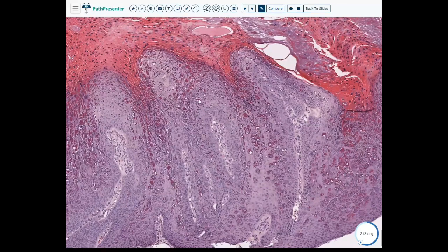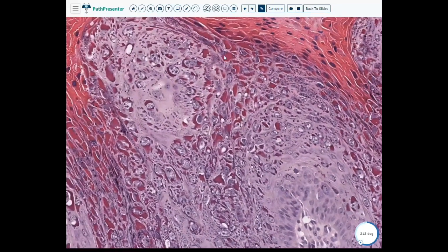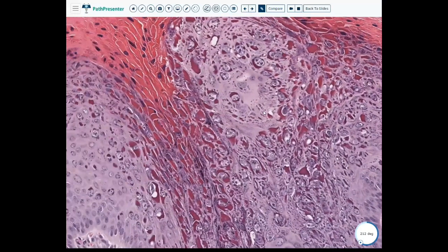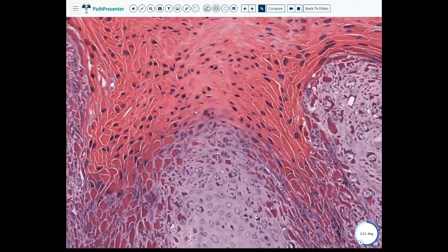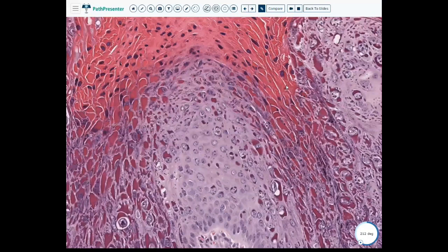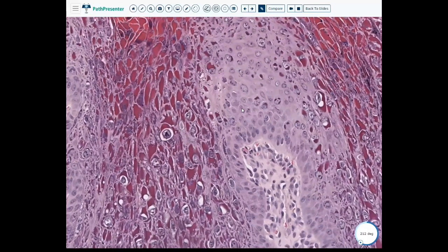These are not necessarily granular layer — these are keratohyaline granules associated with Verruca vulgaris. How do we know this is verruca? Besides that steepling effect with the parakeratosis and acanthosis, here are our halos that we were expecting. You can see more of the granules. Other features we talked about in lectures include hemorrhage — I don't really see hemorrhage in the corneal layer, just a little bit of serum. The halos are present, the inclusions are present.